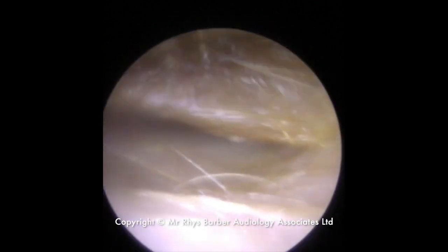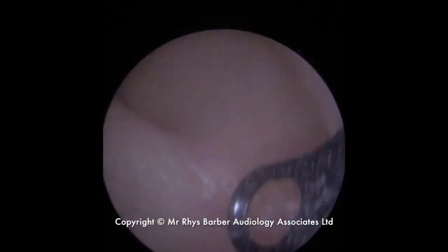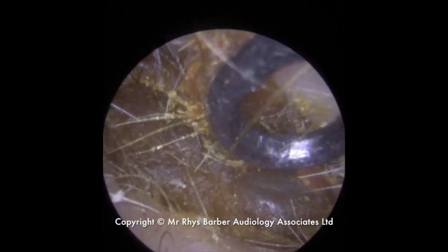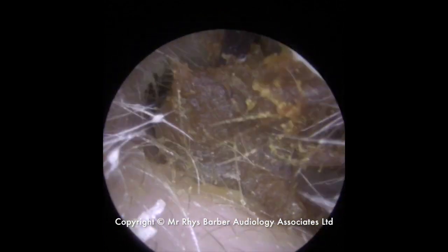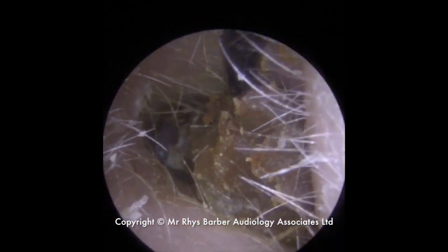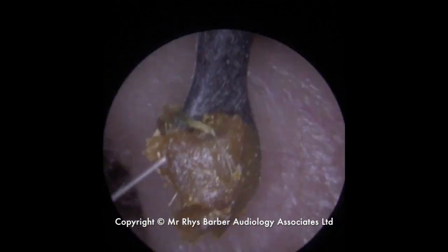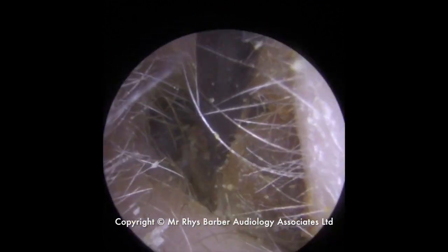What you can see here is quite a hard plate of wax sitting in this gentleman's ear. You can see a lot of the hairs embedded into it, so it's not going to come out easily. And with the consistency of this wax, it's going to be very difficult to remove with suction. You can see that this outer section of wax here is very soft and sticky in nature, so if you put a suction tube into that, it's just going to block the end of the suction. You're not going to get a great deal of suction adhesion in there. It's just going to keep blocking every time.